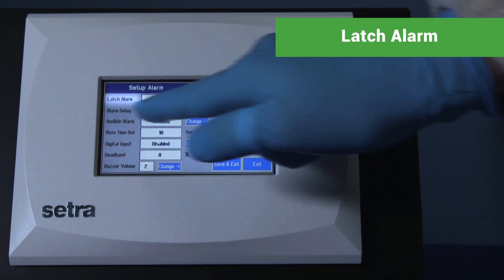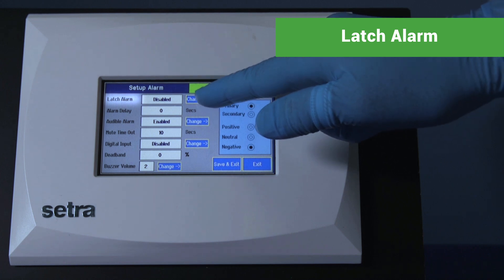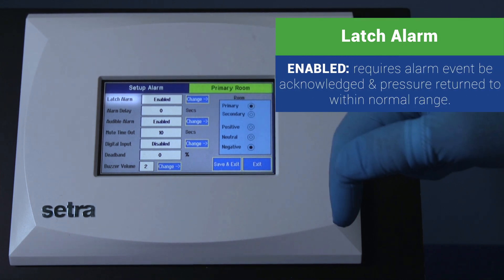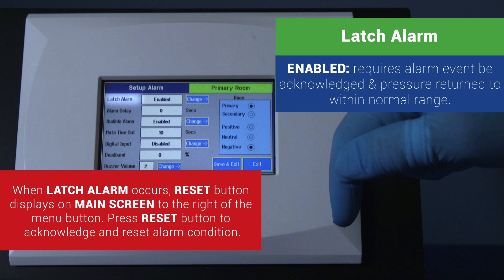Latch alarm — enabled. This requires that an alarm event be acknowledged and that the pressure returns to within the normal range. When a latch alarm occurs, the home screen displays a reset button to the right of the menu button. Press the reset button to acknowledge and reset the latch alarm condition.